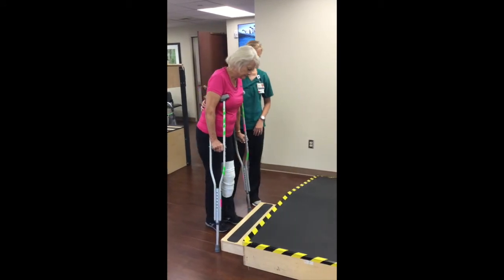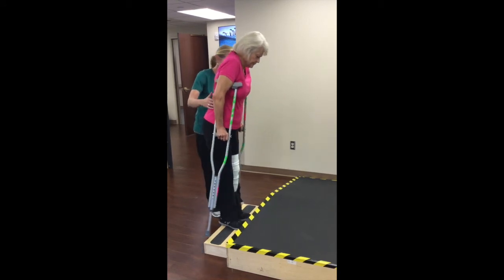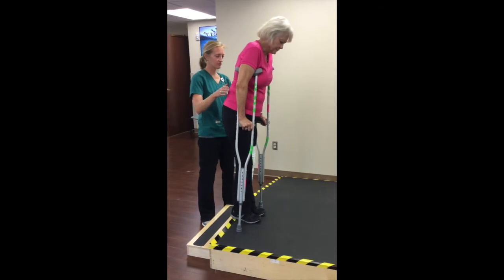With your crutches, stand close to the bottom step. Step up into the first step with your good leg. Bring the crutches and your bad leg into the first step at the same time. Step up into the second step with your good leg. Bring the crutches and your bad leg into the second step at the same time.